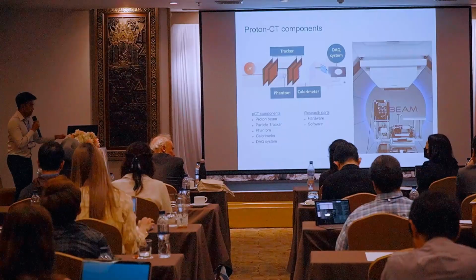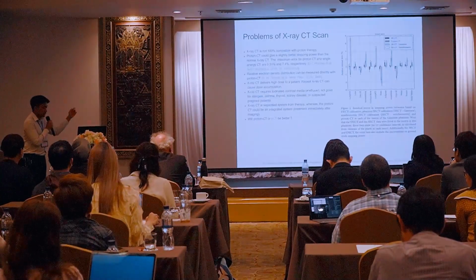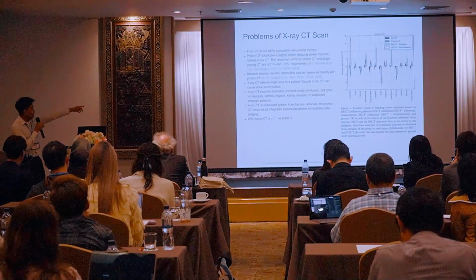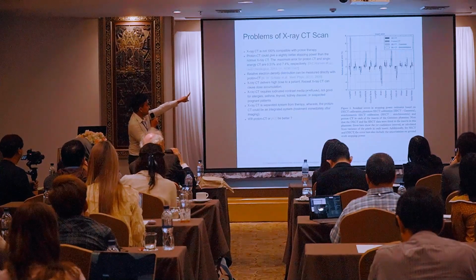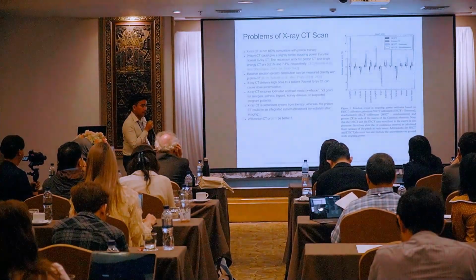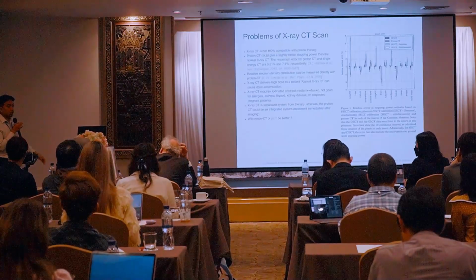Well, to be honest, we have not reached that stage, but we just follow some publications. There are many publications talking about the image reconstruction of proton CT, and most of them say that the resolution is better than the mono CT. Actually, this graph shows the dual energy CT, X-ray CT scan, and single energy CT scan. You can see the uncertainty. The relative residual error on the y-axis is higher than the proton CT. There are some calculations that the uncertainty is lower than the X-ray CT. But we have not reached that stage yet. Our postdoc is doing that now.